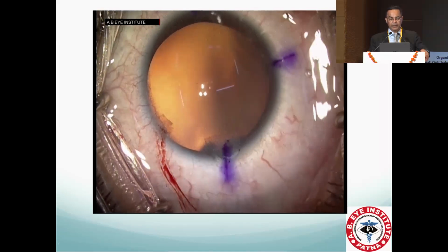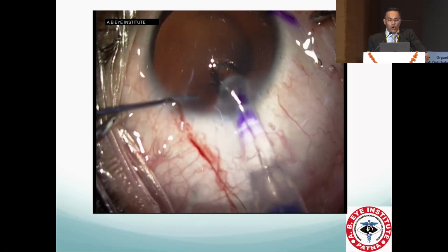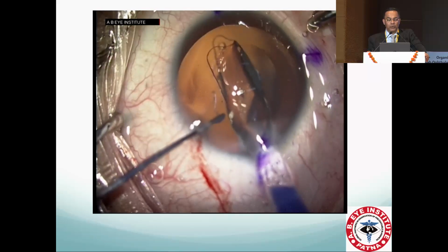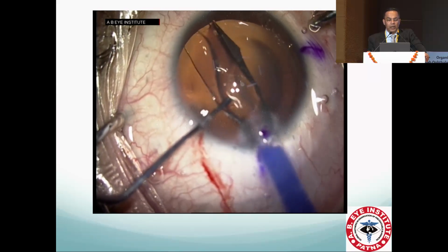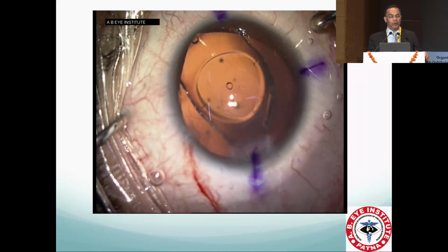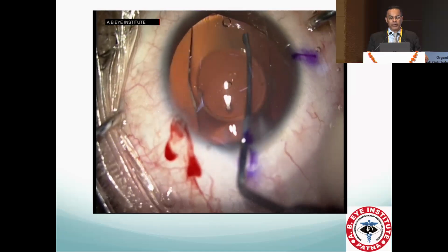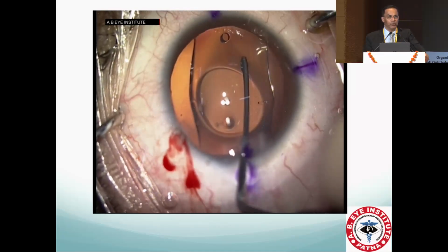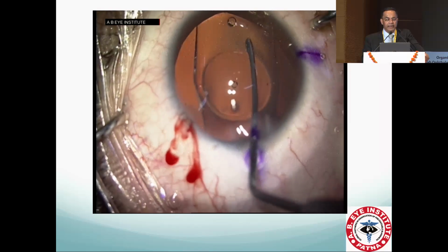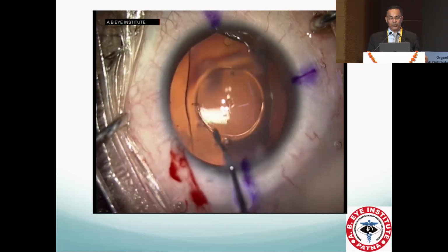So once again, it's just increased a little bit, and see carefully that the top left hole, which should go on the left side, actually turns around and goes to the right side. And actually it had to come on the left side. So now I try to tuck it, I still haven't realized that I have put it upside down. When it doesn't happen, then I am a little worried, and then I realize that it's looking like a ball, and I have put it upside down, and now I need to remove it.